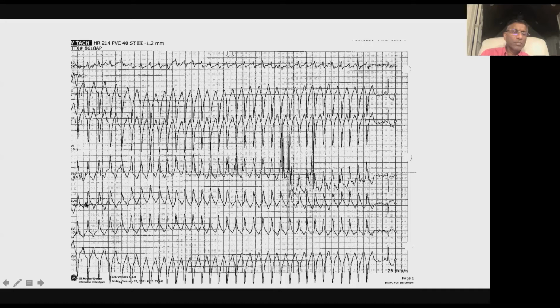We're not seeing the entire P wave. This P wave definitely could not have caused this complex because it's too close to it. So we know it had nothing to do with this. And then when you scroll through, you always look inside these ST segments, in the interval between QRS and QRS. That's the place to look for P waves, right? Between R and R. And look at this, there's some kind of little notch over here.